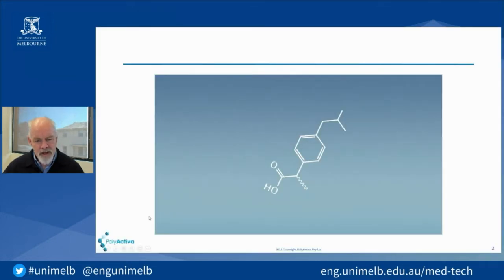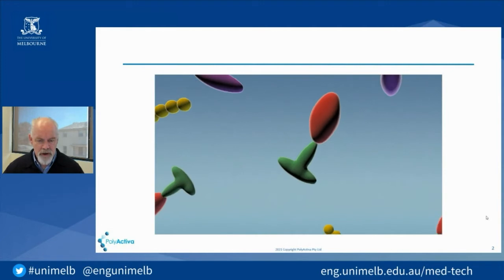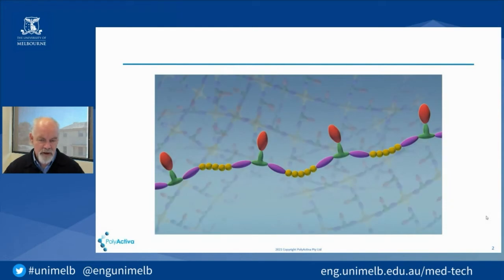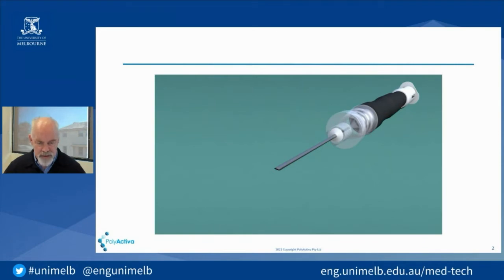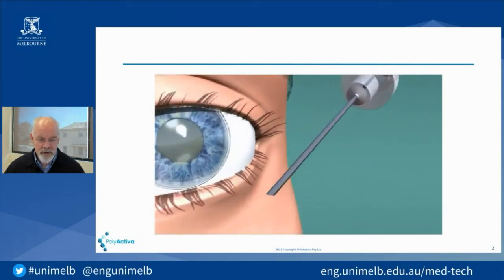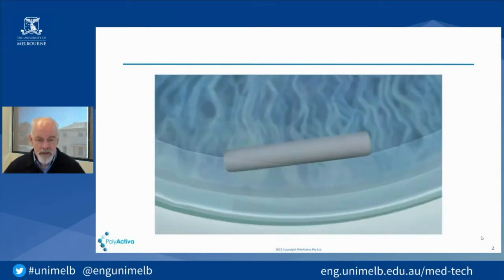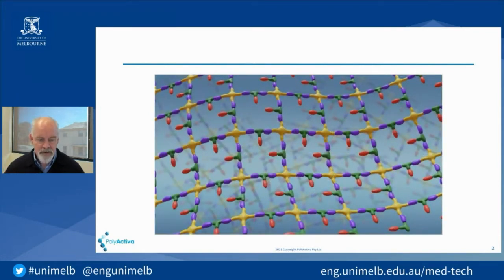So what we do is we take existing drugs that have therapy in the eye, we covalently attach them to an incorporating monomer to build up a bespoke drug polymer conjugate is what we would call it. We then formulate that in such a way that it can be administered as an implant through a custom-built syringe, such that once administered to the site of administration, and we can determine which sites in the eye we would like to place the product, it takes up moisture from the surrounding tissue and it relies on the chemistry of the attachment of the drug to the polymer backbone, which is always pendant, to trigger release of the drug.